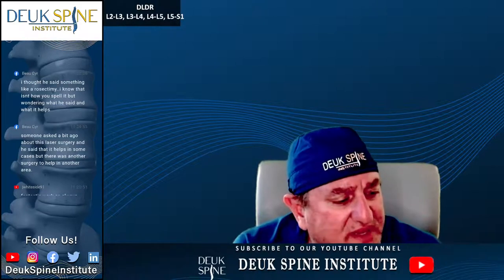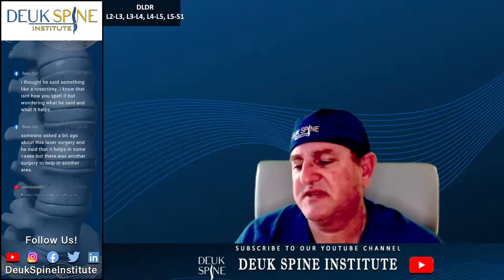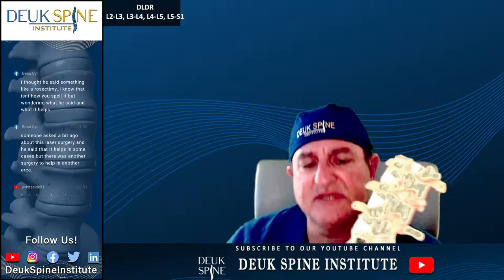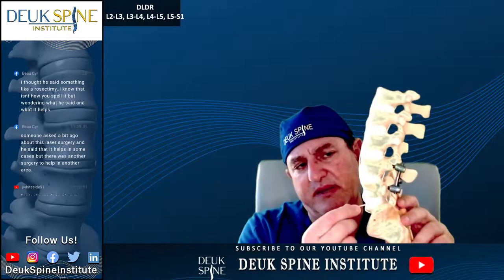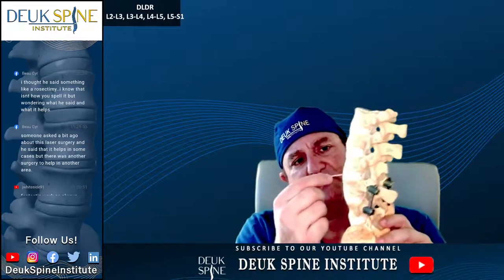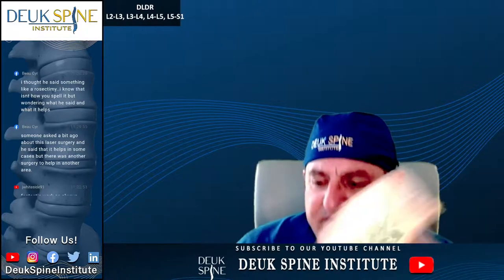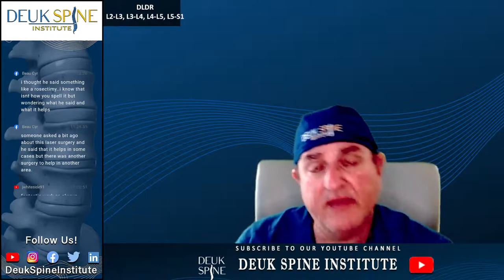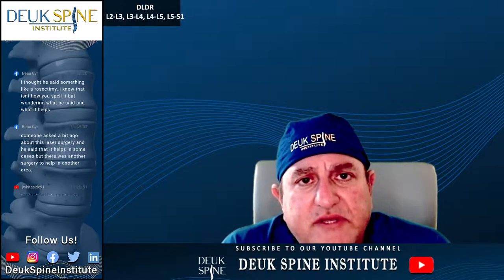So we did a discogram as well. During the discogram, we were testing to see how much pain each of those discs is actually causing. This disc at the bottom was a 10 out of 10 pain. This was a 10 out of 10 pain, this was a 10 out of 10 pain, and this was a 10 out of 10 pain. So we basically had four discs that were 10 out of 10 pain, and those are the four we fixed. So I expect that pain to be gone now that we've done the Deuk laser disc repair.